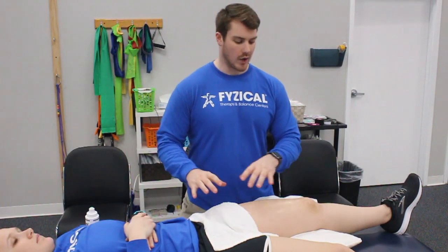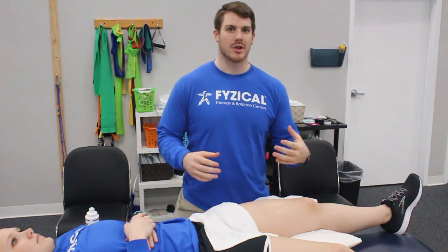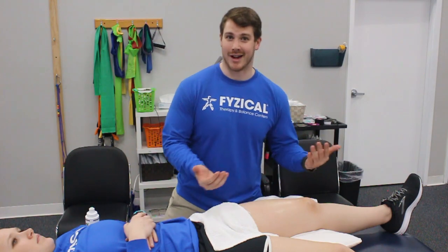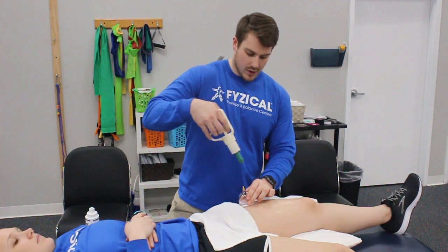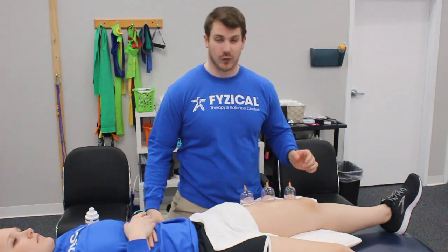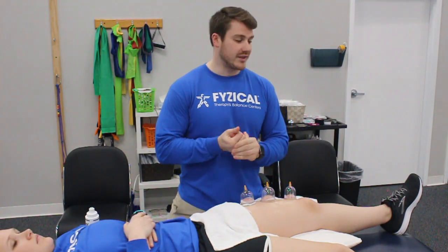Lastly, let's focus on the quadriceps muscle in the front of the thigh. You have four quadriceps muscles, but today I'm going to show cupping of the middle area towards the outside — your rectus femoris and vastus lateralis, which is just a fancy way of saying the middle and outside part of the quadriceps. If these areas are tight, you could have outside tracking of the kneecap, which is a cause for patellofemoral pain syndrome, as well as possibly a quadriceps tendon strain, or this could even help a patellar tendonitis as a result of a tight quadriceps muscle.